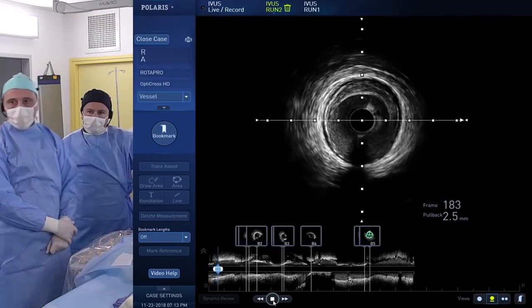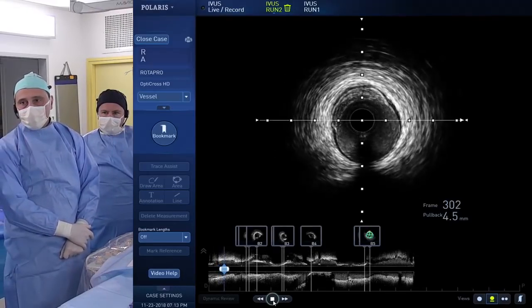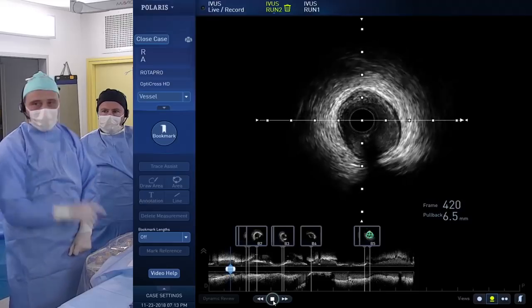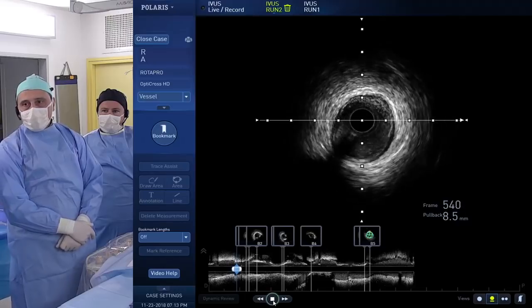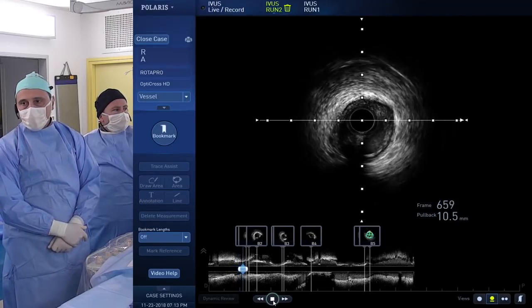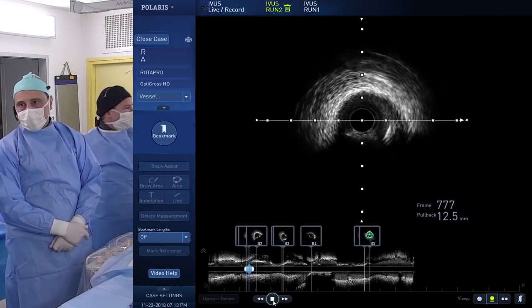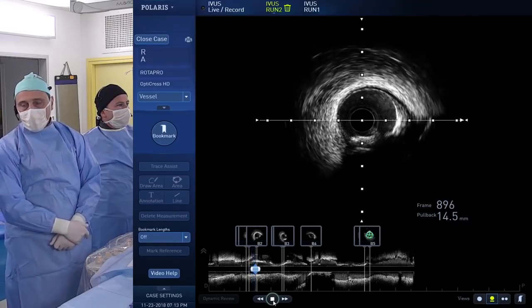Yeah, sure. That would be the so-called landing zone of our stent, which is perhaps the only segment free of disease, even though there is some plaque, as we have seen. Here we start to have some encroachment, but no major calcification. But you will see in a short while, pulling back, here we have calcification between 3 o'clock and 9 o'clock.